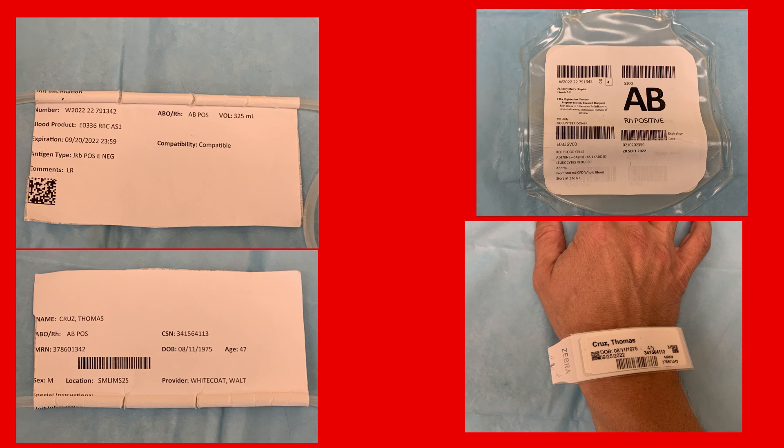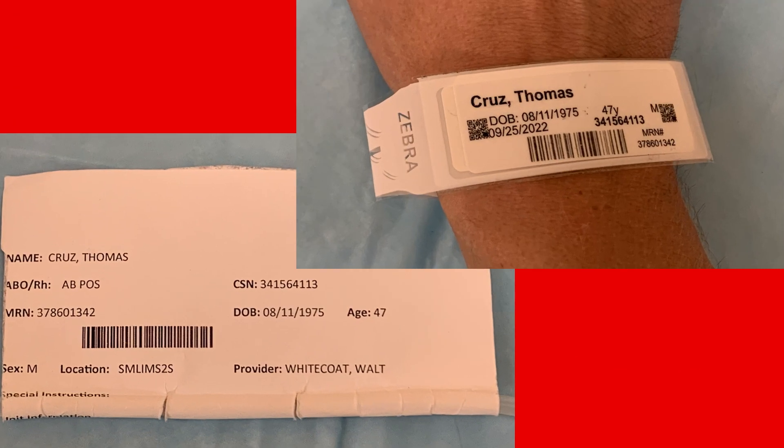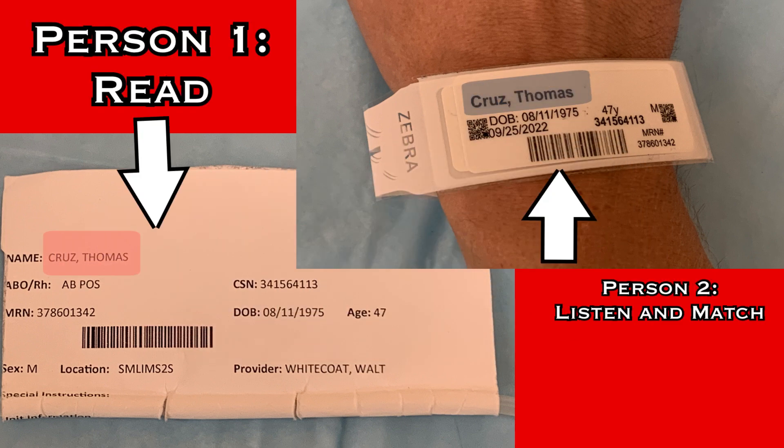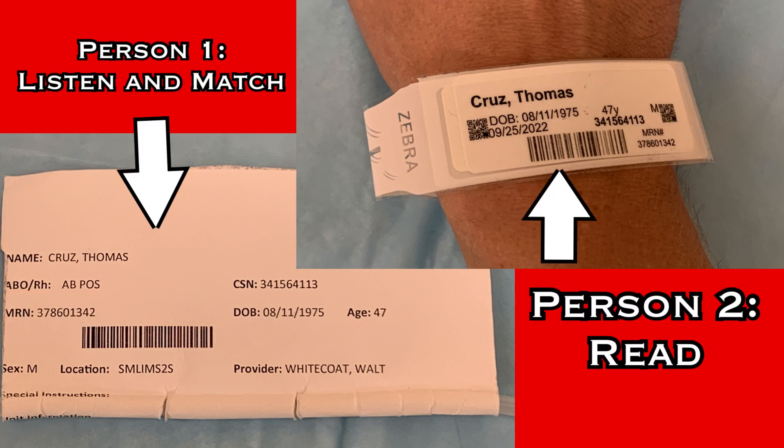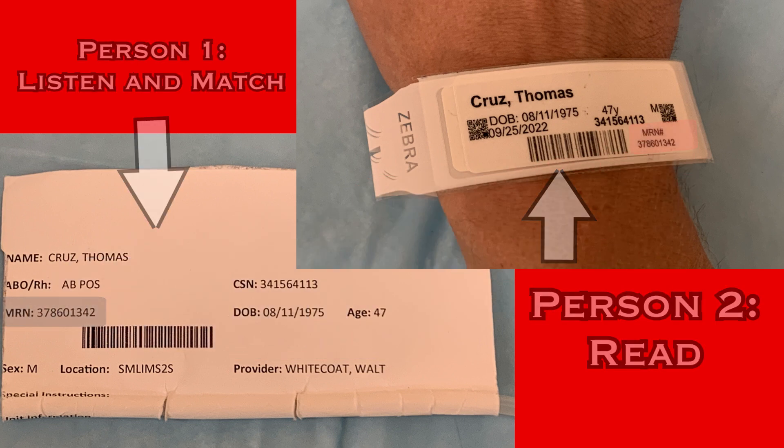Begin by verifying the patient. One person will read from the sticker attached to the blood product, while the other listens and matches that to the patient's wristband. Read and spell the patient name: Thomas Cruz, T-H-O-M-A-S C-R-U-Z. Read the birthday: date of birth 8-11-1975. And read the MRN. Now reverse the process, and the listener will read off the wristband as the partner matches to the sticker: Thomas Cruz, T-H-O-M-A-S C-R-U-Z, date of birth 8-11-1975, MRN 378-601-342.